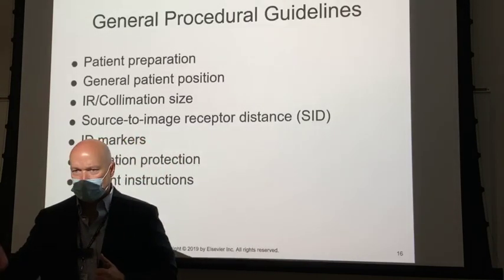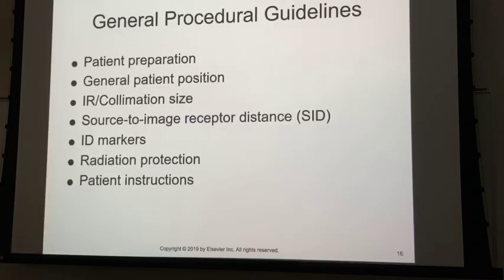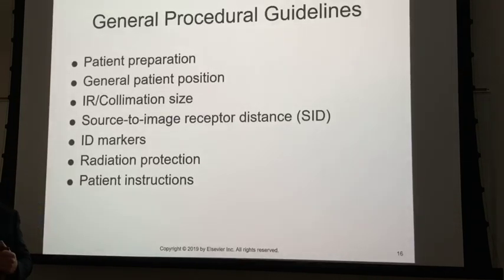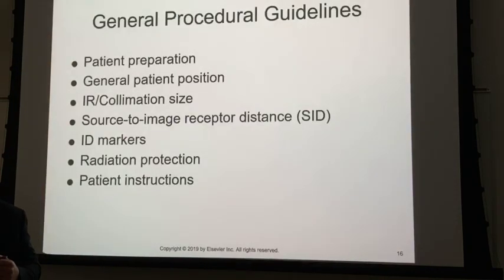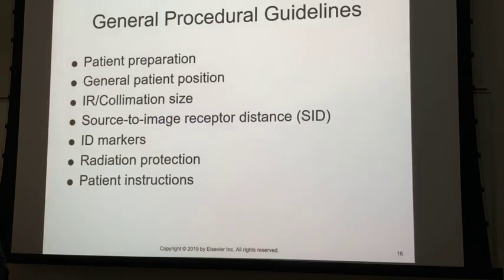Some of your doctors, anybody in Jacksonville? Okay, ETMC, yeah, or UT, yeah. It'll always be ETMC. Dr. Bennett's pretty specific on how he wants his markers used. So if you rotate out to Jacksonville and you're at UT Health, make sure that you familiarize yourself with his policies. Some of your older techs will be pretty specific in where they want the marker placed. My personal opinion is if it's a proper marker and it's on the image receptor and it's not in the anatomy, it's marked, right? But some people are pretty particular, so make sure that you know that.